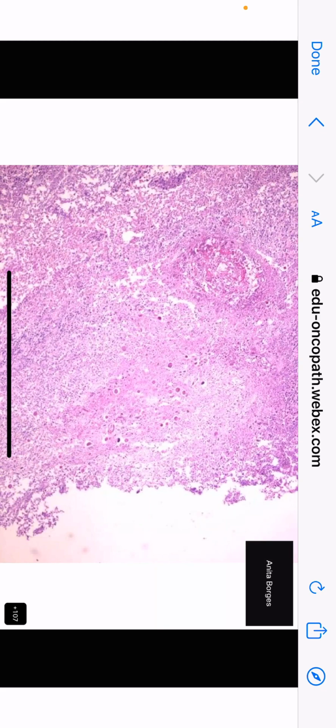What do you see here? What is there here, Limpy? Some round things. Yes, structures. Okay, very good. Anything else? Trophozoites. What is this? Ah, yes, round specific bodies.